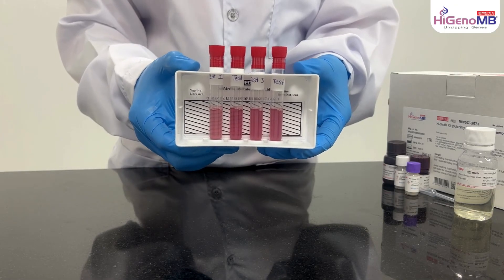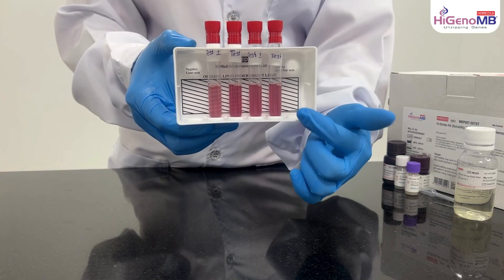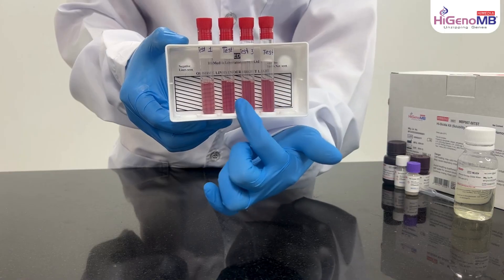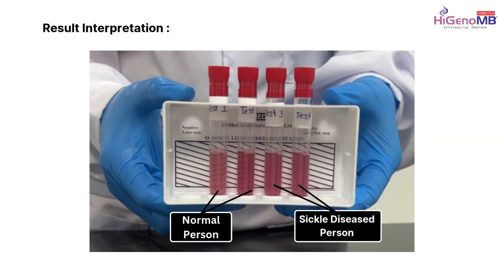But in the third and fourth tube, the solution is turbid and we can't see the black lines behind the tube. That means the first two tubes contain the blood of a normal person, and the third and fourth contain the blood of a sickle cell disease person.